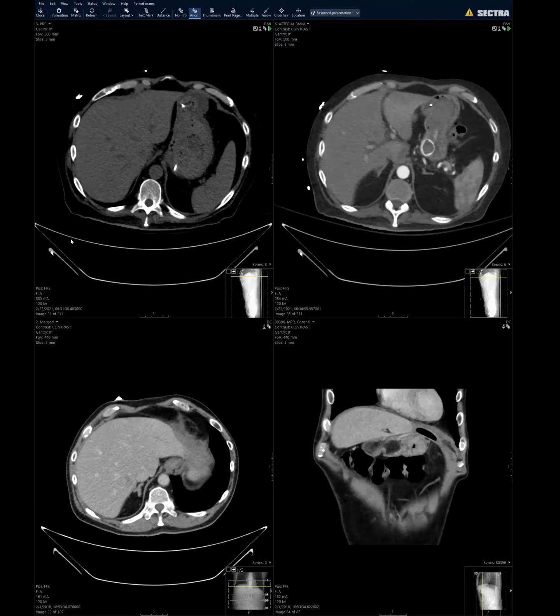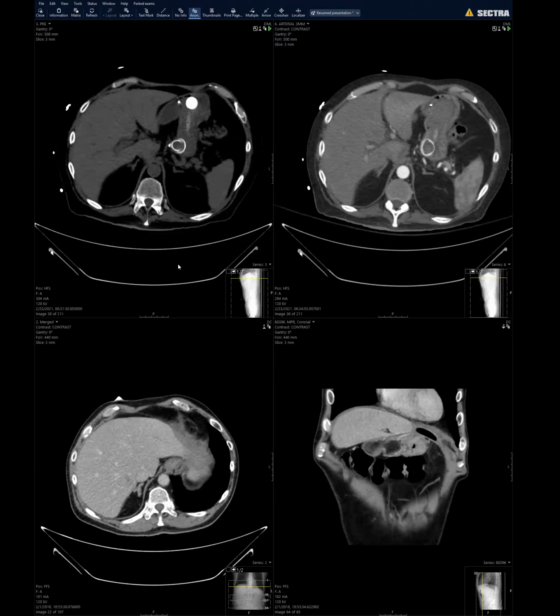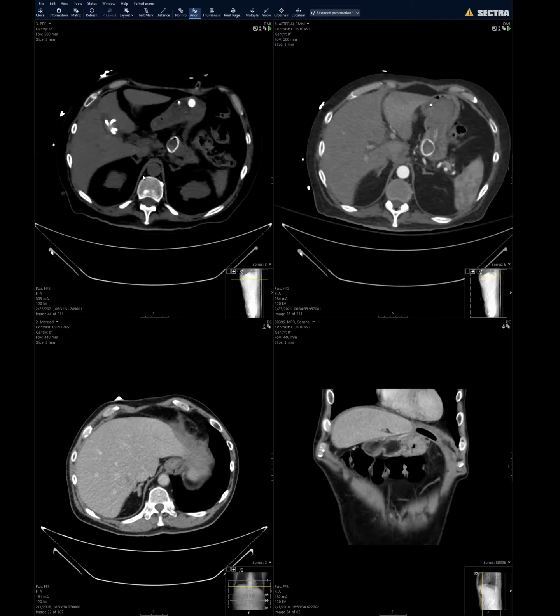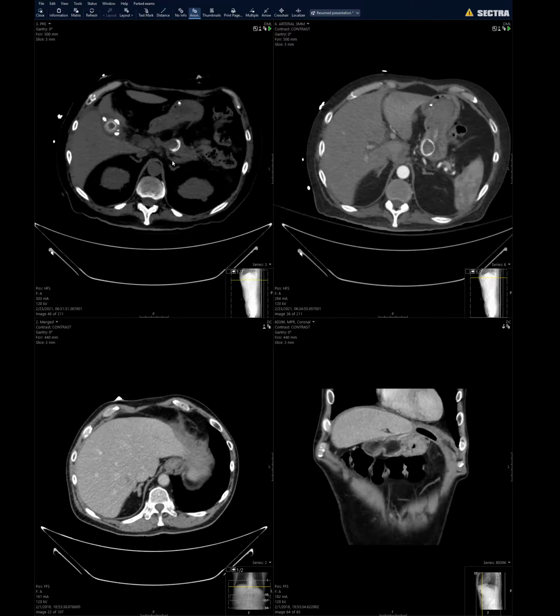Okay, who else? I just have a quick one. I can go. It's a straightforward one. So, a patient with known history of pancreatitis. He had gallstone pancreatitis, so he ended up getting a cholecystostomy tube. He was in renal failure and everything, so couldn't get surgery emergently. So he has a chole tube.